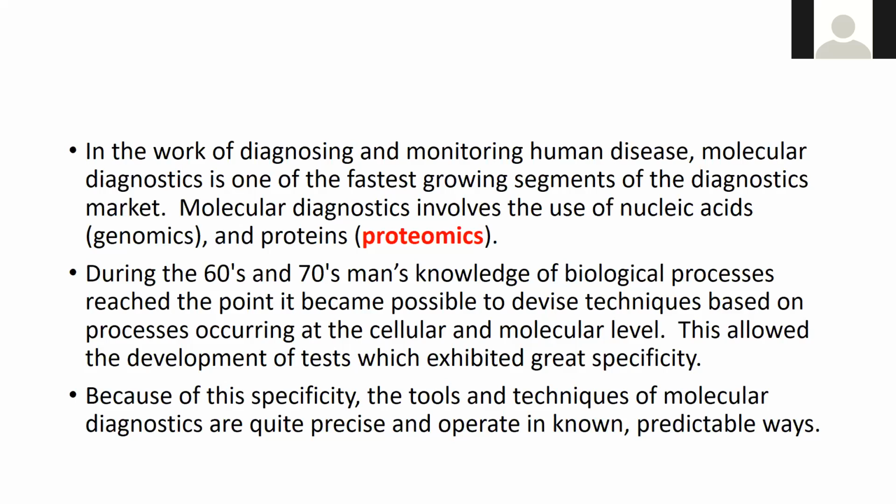Just, we have to keep the sensitivity going. And there actually is new technology now that helps with that. I don't know if it's in here or not, but it is one where it monitors, with a video camera, the growth of the organism in the well with the antibiotic. If the growth is quick, it will say that organism is going to be resistant to that antibiotic. And if the growth is minimum or nothing, it will tell you it's sensitive, and it will give you a quicker response. It's monitoring the growth in the well without you being there. You don't have to be there to look at it. So that's really neat. I think UAMS has a couple of those in their lab. So if you end up in a bigger lab, you will probably be using that technology.